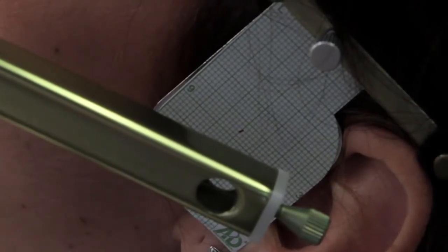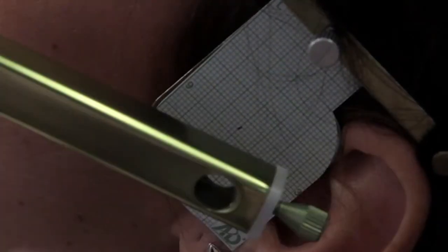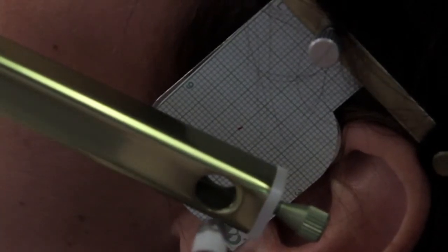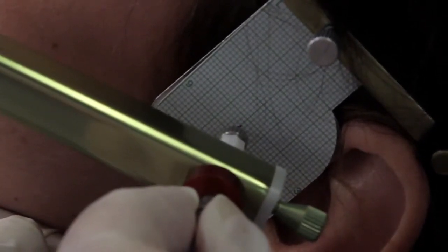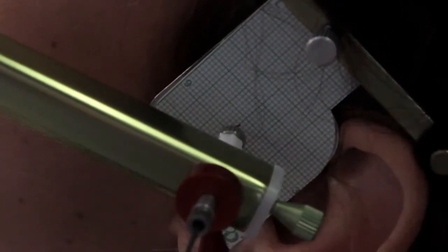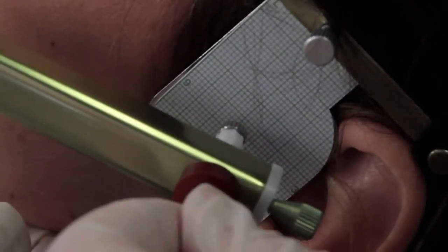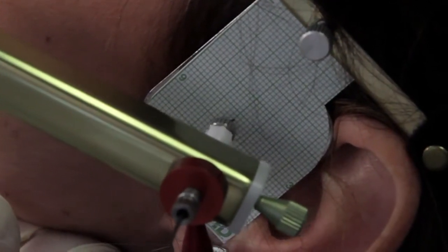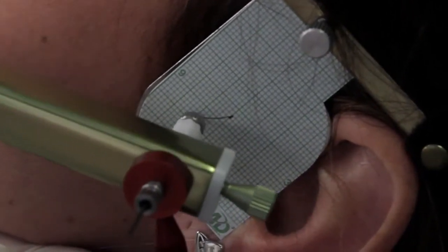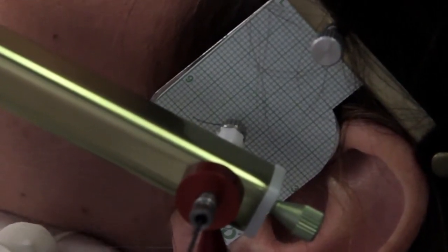So we're going to use the black lead. Pull it back first and lock it. There, now lock it. Okay. Now lock the position. That one. Now unlock. Let it move in. Good. Okay. Now Ali, move straight forward. Keep going. Go back. Open big. Go back. All the way. Close all the way. Close all the way. Atta girl. Now then stop.